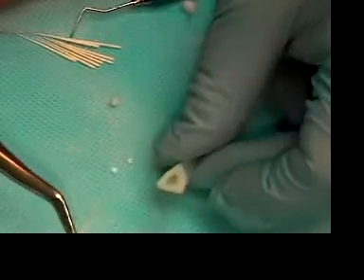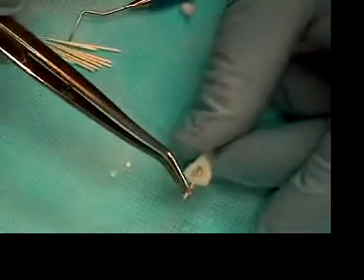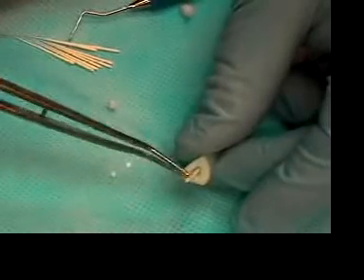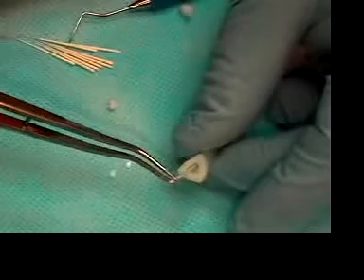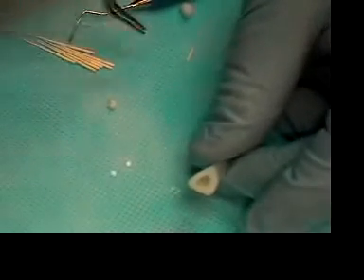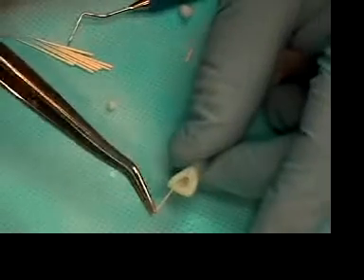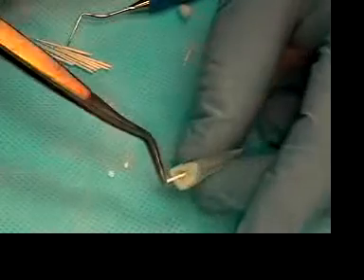The other way is with paper points. The coarse paper points are the best ones to use. You don't want to take the paper point and plunge it into the canal — you want to slowly place it in the canal to let the moisture absorb into the paper point. If you plunge it in, you run the risk clinically of forcing the material apically.